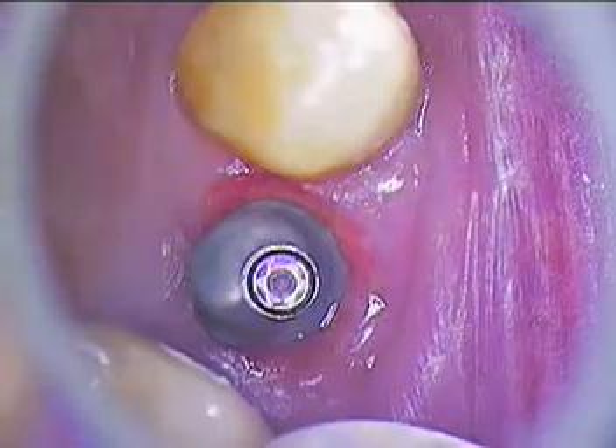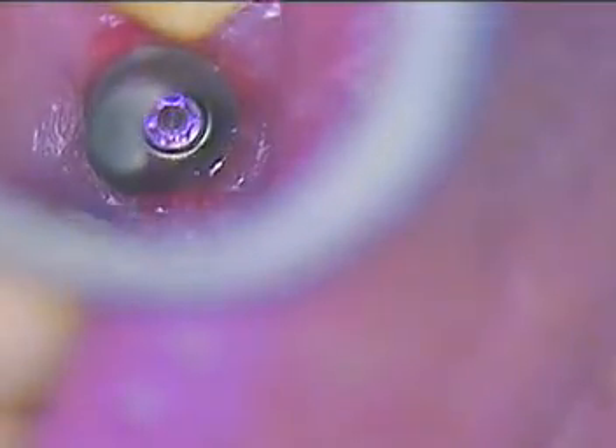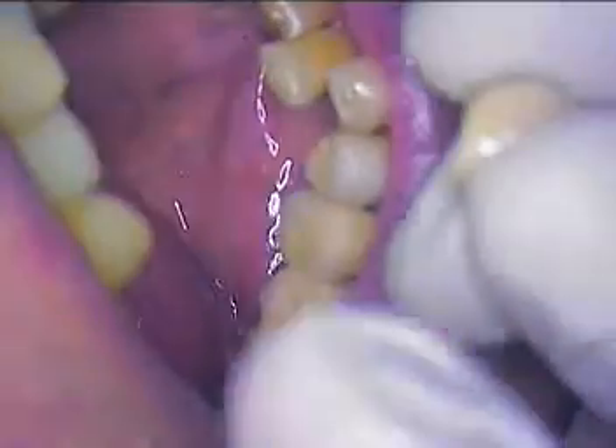I'm going to hand tighten this first to make sure we have a good seat, and then try the crown. I'll back up the magnification so you can see how everything goes into place. This is the first try-in, and it goes in like so — to my hand it feels a little tight right now.